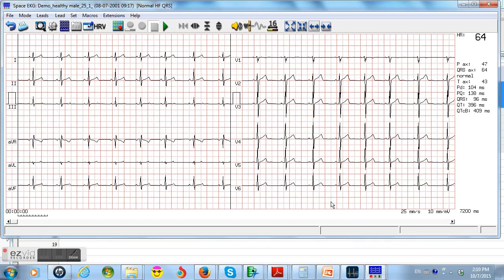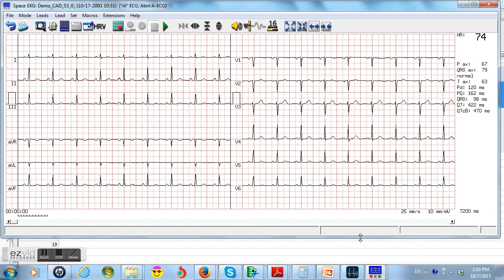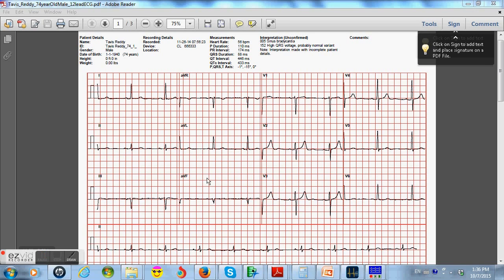This was video number 1, patient number 1, normal ECG, ended up healthy on all of our A-ECG scores. Video number 2 was from the female diabetic who had basically a normal ECG, maybe slightly prolonged P wave. She ends up in the coronary disease sphere. Video number 3 was the person who had a more abnormal ECG with T wave changes, poor R wave progression, but still non-specifically abnormal, who ends up in non-ischemic cardiomyopathy.